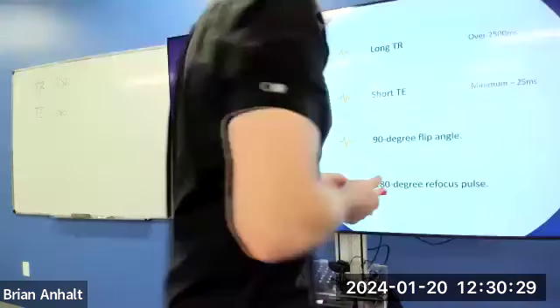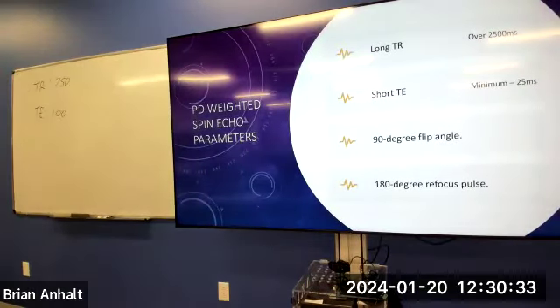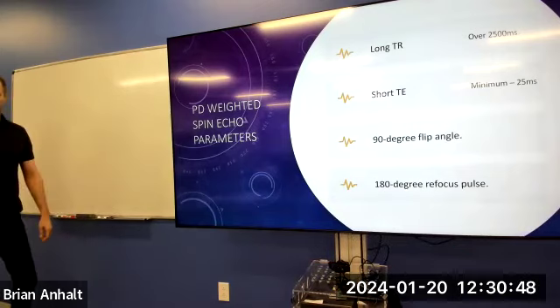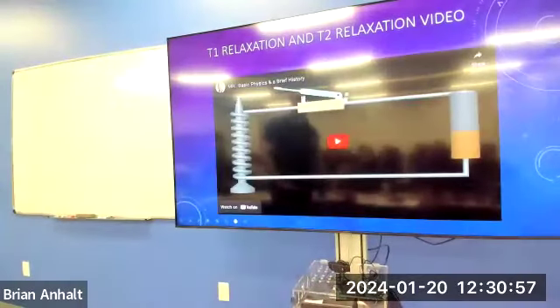So those are parameters. I won't trick you like that yet, but towards the end of the semester, I'm gonna give you improper parameters on the next quiz, but you gotta keep practicing this. That might show up, not that exact one, but it'll look like an artifact. It'll just look like signal, but it won't look like much. Look really dark. You won't see a lot.